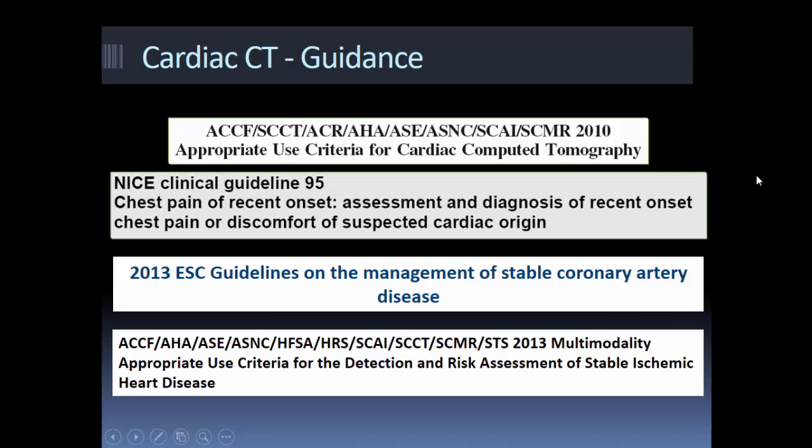Okay, so the main guidelines, or you can say appropriateness criteria, for different indications for cardiac CT angiography are in this document, which came out back in 2010, and I think it's being revised now, but no new edition has come out. This is an expert consensus document, mostly from people doing cardiac imaging in America. And this probably gives the most practical indications where most experts agree where cardiac CT angiography is a useful technique or not a useful technique. So that's exclusive to cardiac CT angiography.